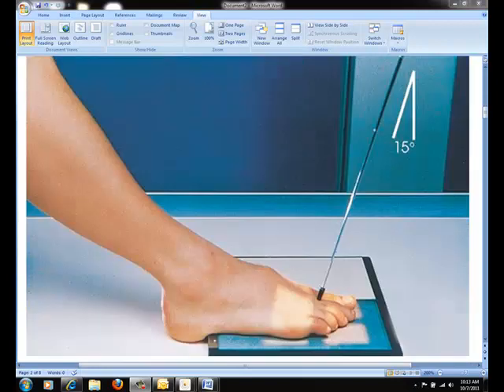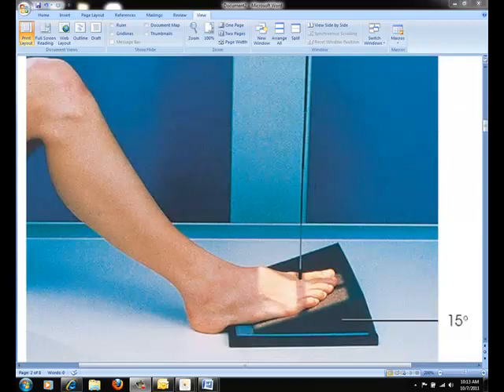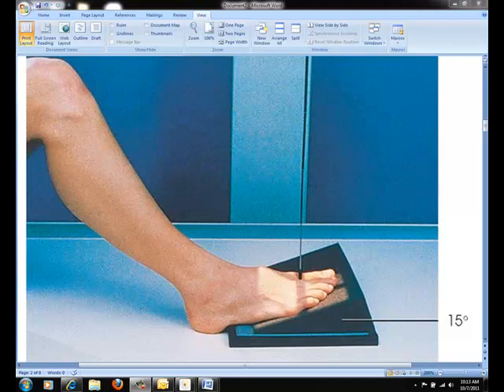Here is an example of directing the central ray 15 degrees posteriorly through the third MTP joint. And seen here is an example of the 15 degree foam wedge with the perpendicular central ray.